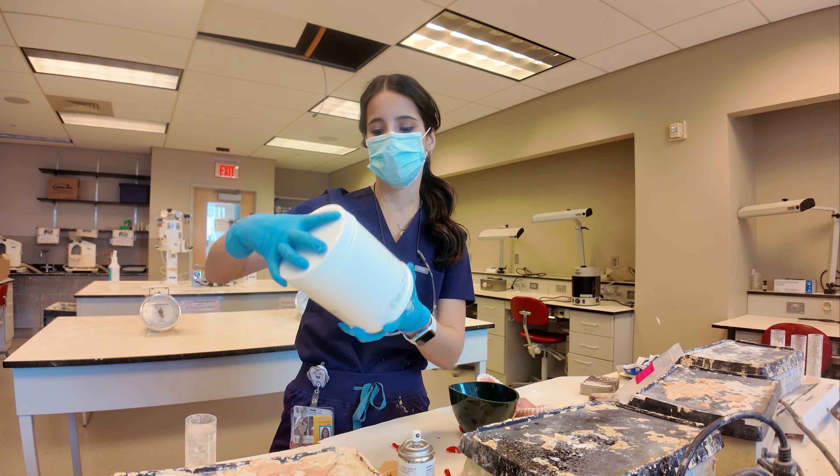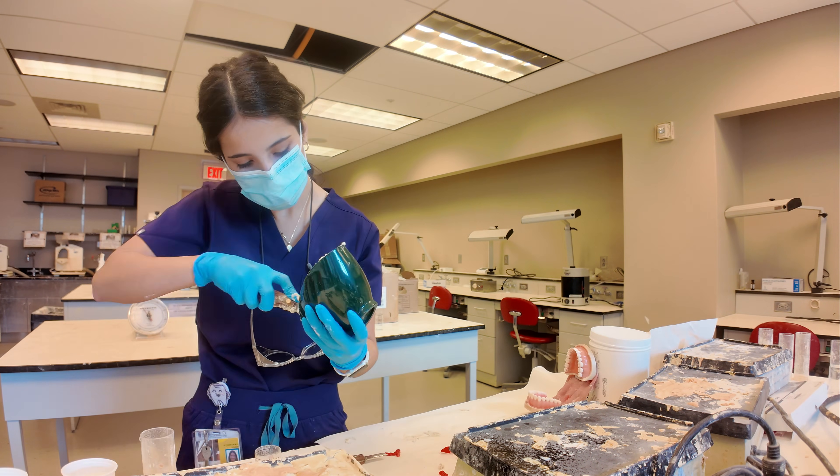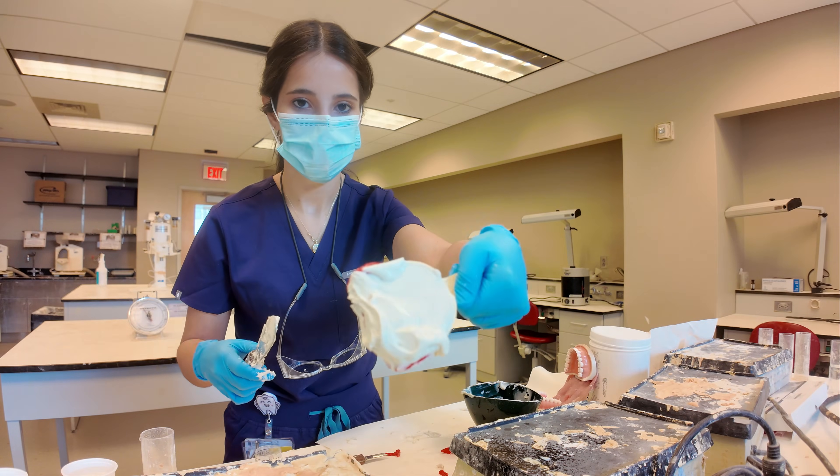This is some tray adhesive. Now it's time for the alginate. When mixing alginate, you have to work fast because of the short setting time. I put it on the tray, made sure it was nice and smooth, and then I took my impression.